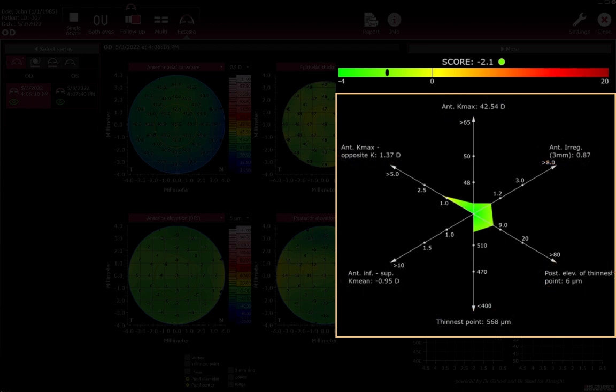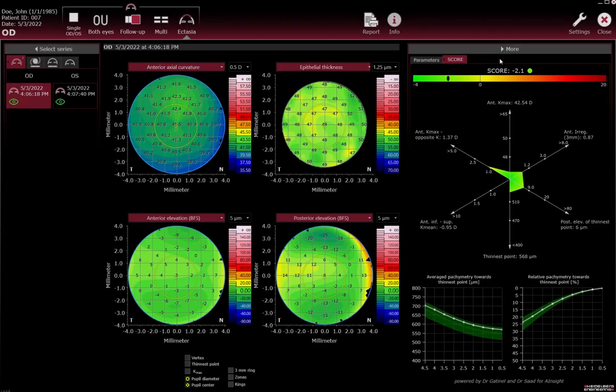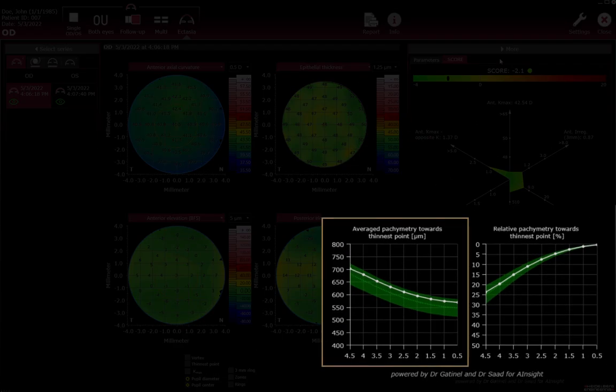The colours in the radar map correspond to the colours in the score bar. The expansion of the coloured areas towards the arrowheads illustrates how high the values are. The more colours displayed in the radar map and the further the coloured areas extend to the arrowheads, the higher the probability of ectatic changes. The average pachymetry graph shows the patient's mean corneal thickness towards the thinnest point.